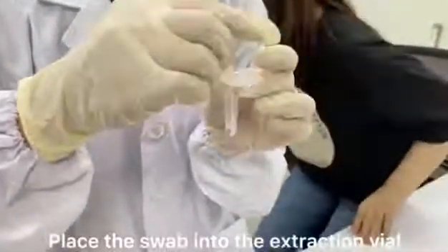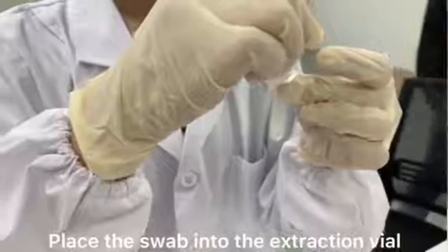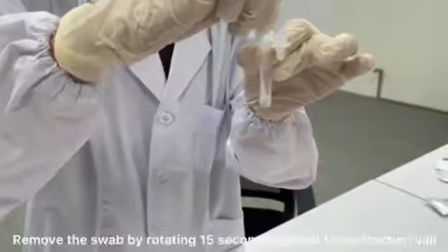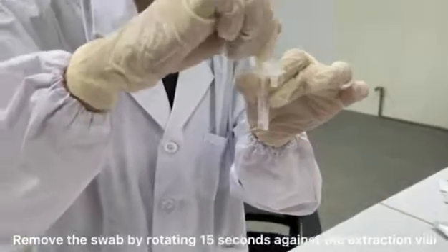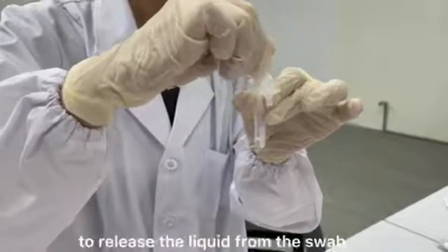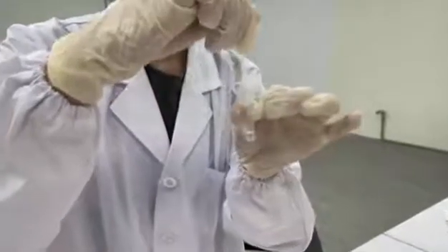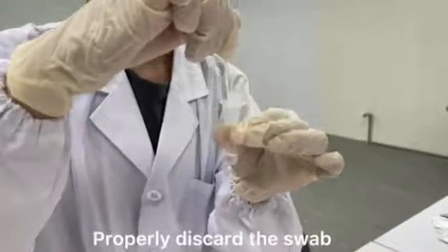Place the swab into the extraction vial. Rotate the swab vigorously at least 5 times. Remove the swab by rotating for 15 seconds against the side of the extraction vial while squeezing the vial to release the liquid from the swab. Properly discard the swab.